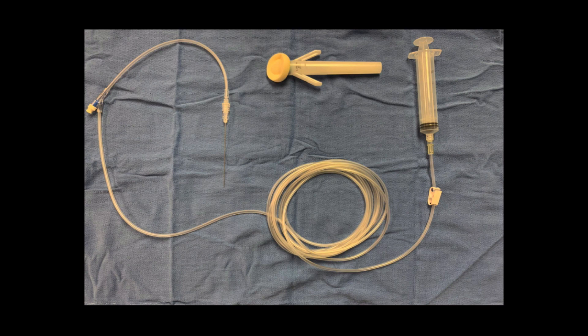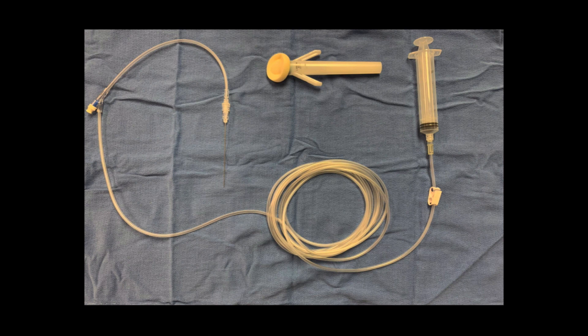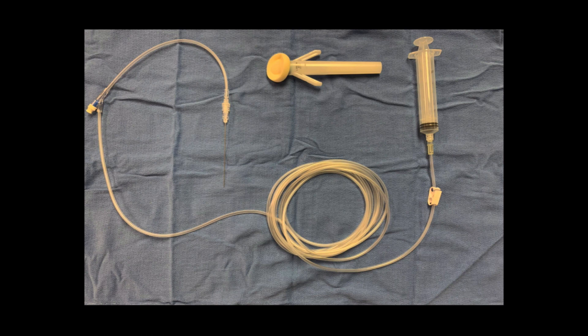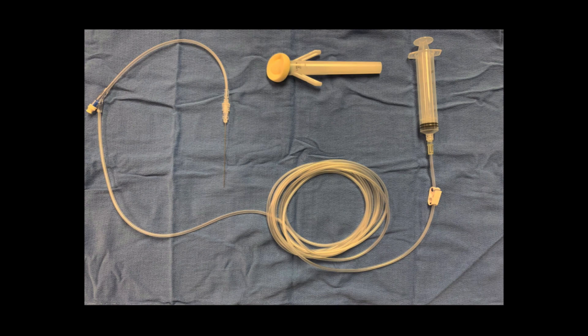Like all plane blocks, volume is your friend. Most sources recommend 30 milliliters of fluid for the block. Respiratory motion of the chest wall helps the anesthetic move to cover the entire chest wall. I included this picture of a nerve block setup — the 30cc syringe is hooked up to IV extension tubing so another set of hands can push the anesthetic while you have fine motor control of the needle in one hand and the probe in the other. In this setup, a spinal needle is utilized.